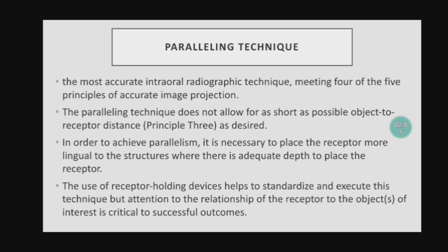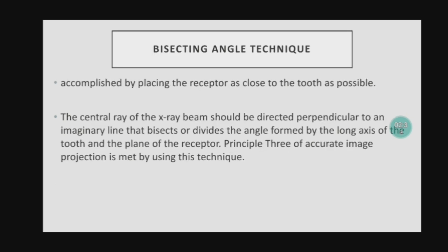In order to achieve parallelism, it is necessary to place the receptor more lingual to the structures where there is adequate depth to place the receptor. The use of receptor holding devices helps to standardize and execute this technique, but attention to the relationship of the receptor to the objects of interest is critical to successful outcomes.